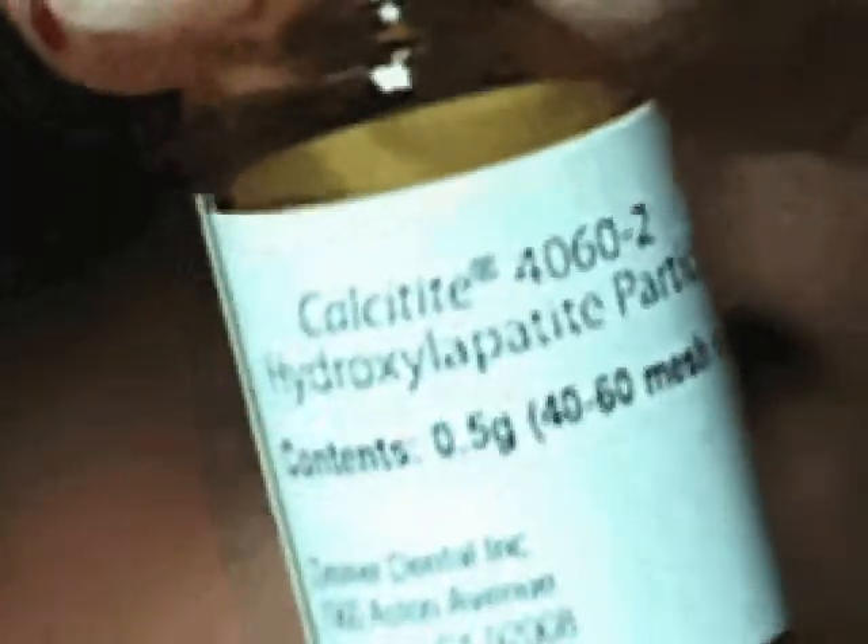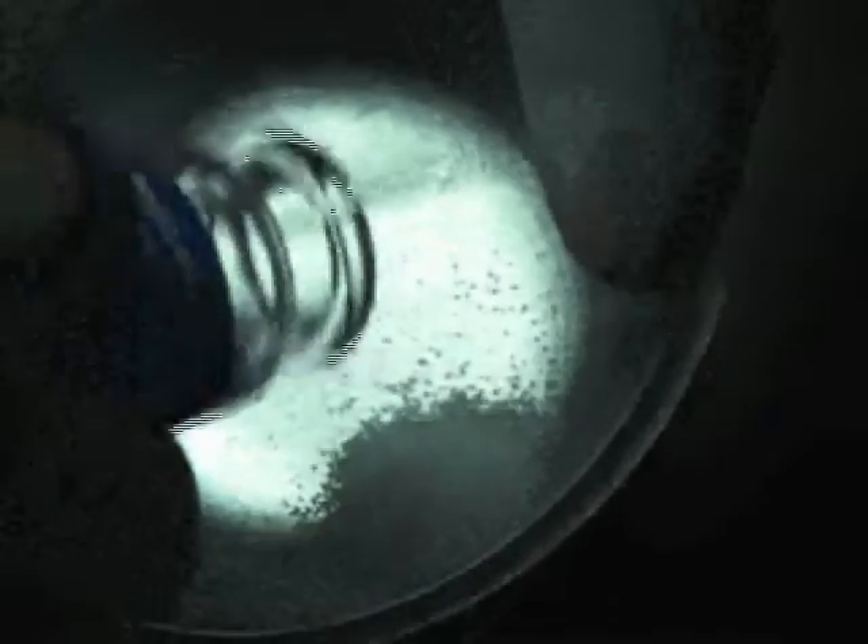I'm going to be using Calcitite, which is going to be the body of the graft. We're going to mix this 50-50 with OsteoGen, which is a pure crystalline HA, and we're going to fluoridate both of them together. So this is a half a gram of dense HA, which we're going to pour in, and now we'll add the OsteoGen — matching the volume so we end up with about a gram. Then I mix that together with the concentrated fluoride solution for about 2 minutes.